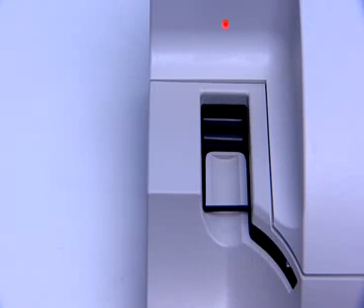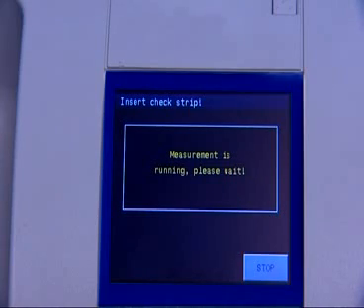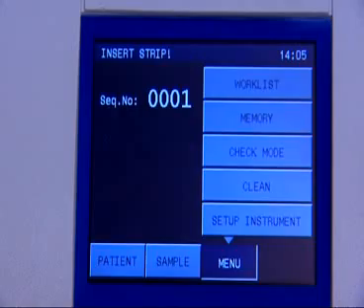Automatic calibration and checks of the LoRa Reader are carried out after every power-up. The system checks of the optical parts are carried out by measuring control strips, and the evaluation is then printed.